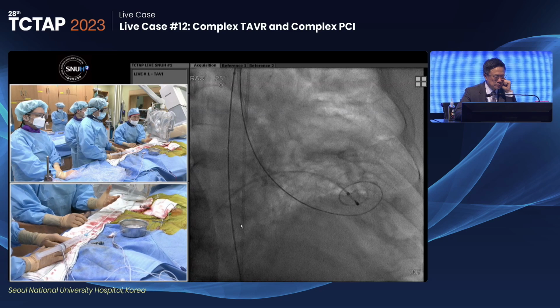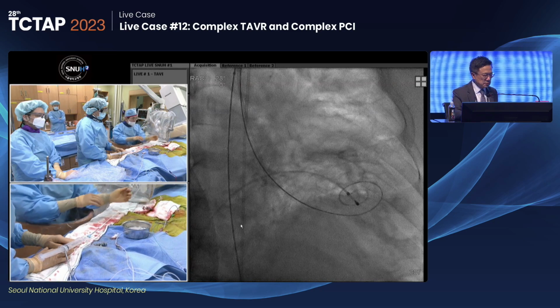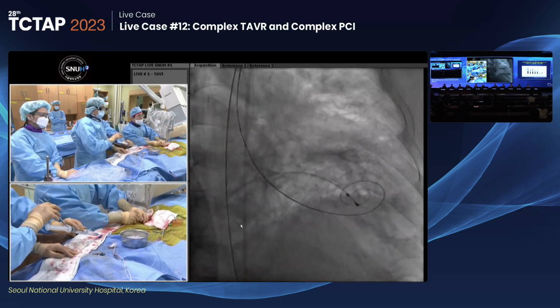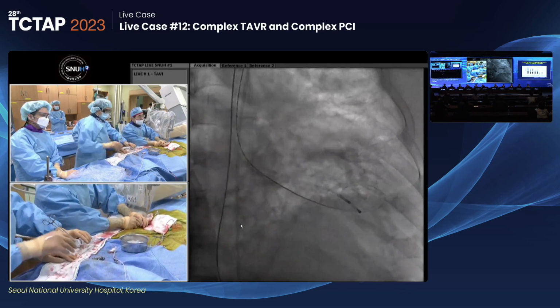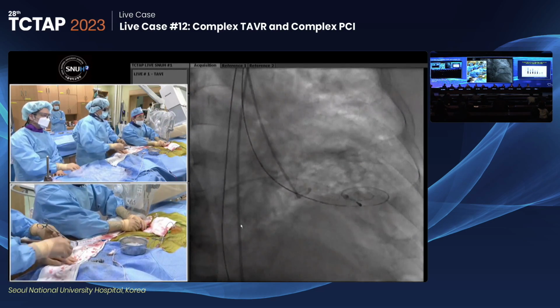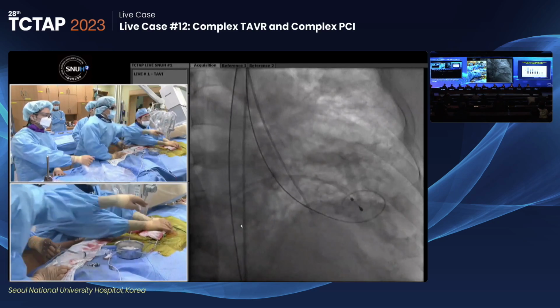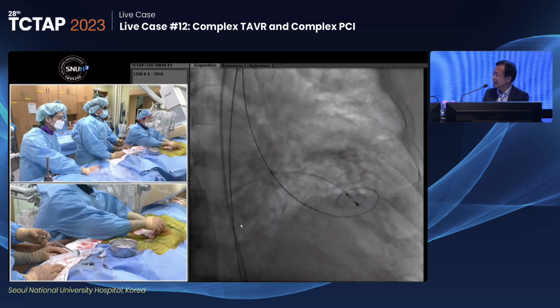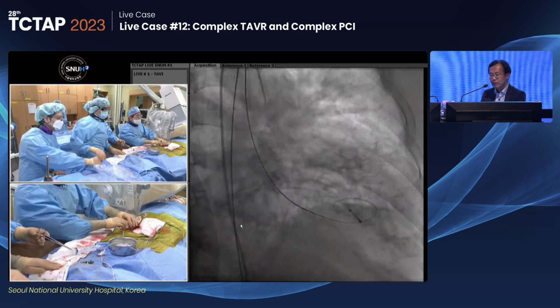That would be about 10% for this case. Okay, Michael, do you have a comment? No, I'm just saying that if Eberhard is going to do TAVR, I'm going to put in an Accurate Neo. Is Neo also available in Hong Kong? Yes, we have it. We don't have much experience. We're just starting the Accurate Neo 2 program.